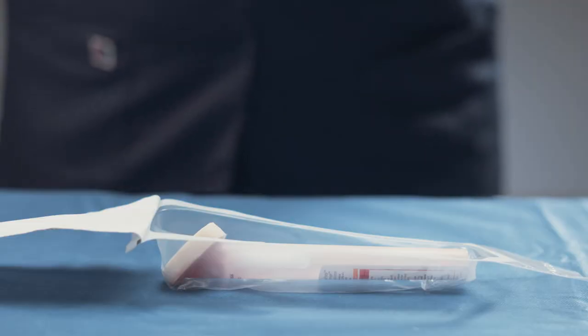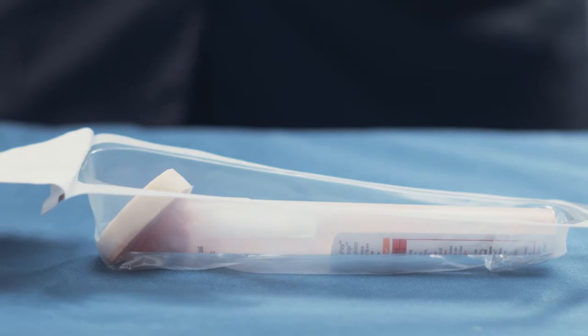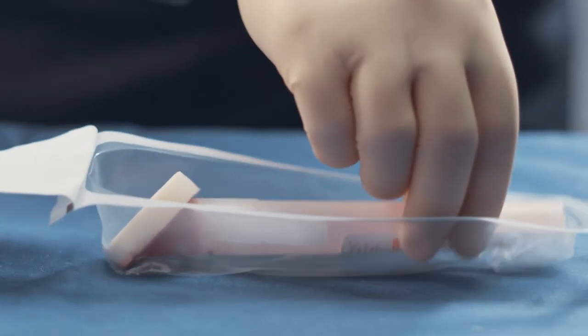To get started, remove the 10.5 milliliter applicator from its packaging, making sure to practice aseptic technique. Do not touch the sponge.